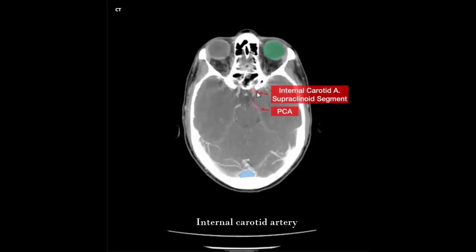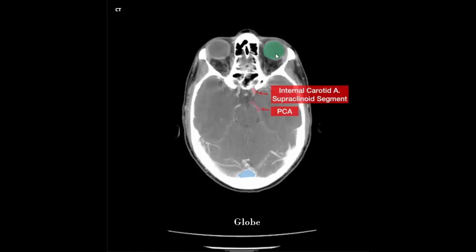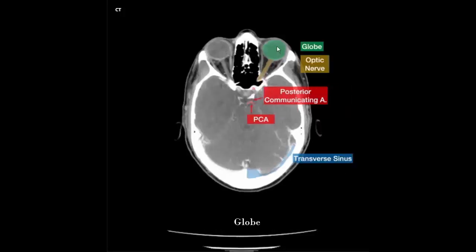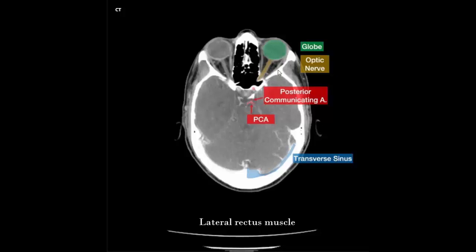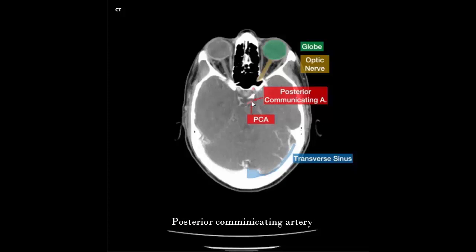Right and left internal carotid artery. Posterior cerebral artery, right and left globe. Right and left globe, right and left medial rectus muscle, right and left optic nerve. Right and left lateral rectus muscle, right and left internal carotid artery, posterior communicating artery, posterior cerebral artery, transverse sinus.